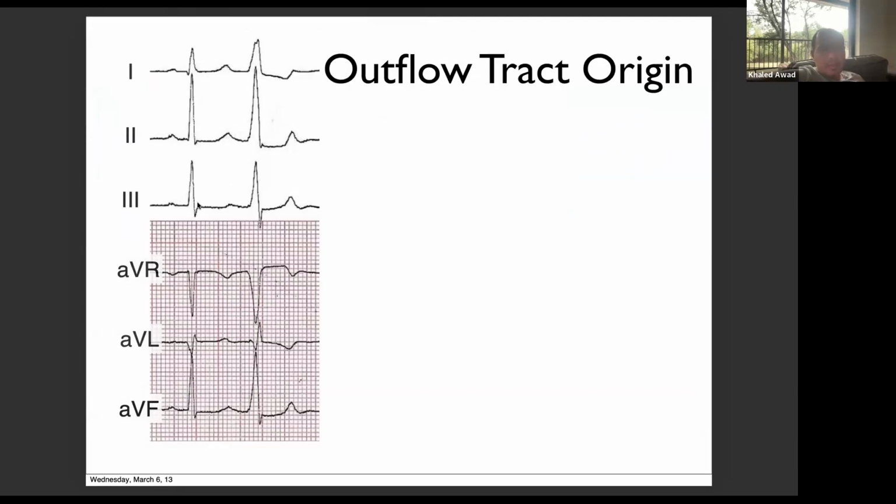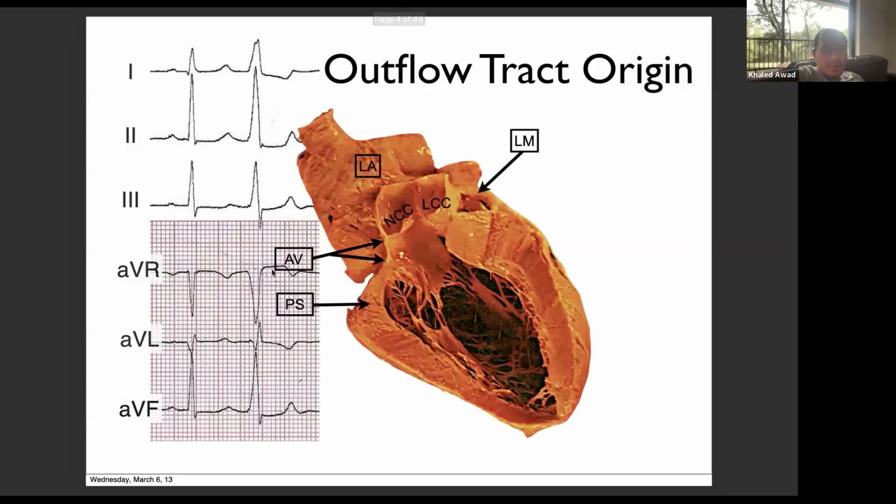Relative to the power of ablation tools that we have, it's like dropping an atomic bomb to kill a cockroach, but you have to be in the right spot. If you drop an atomic bomb in a different country, it's not going to kill a roach in a country that is thousands of miles away. And so you got to be in the right spot for this to work.